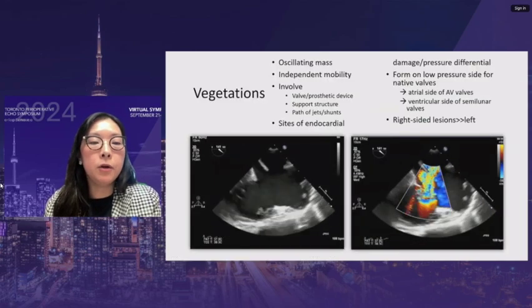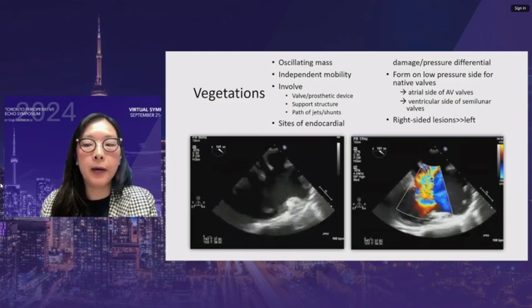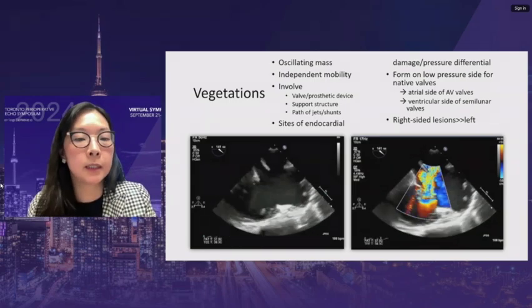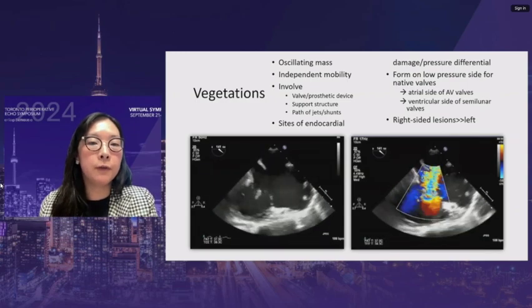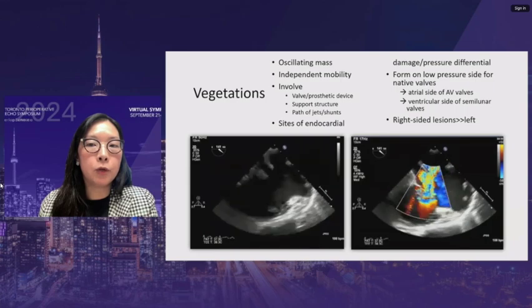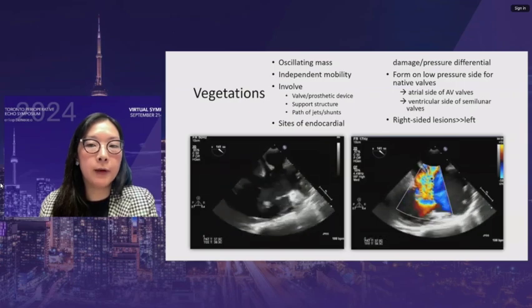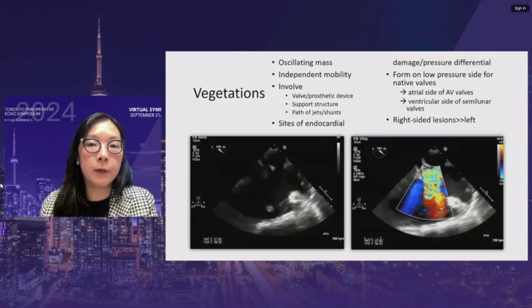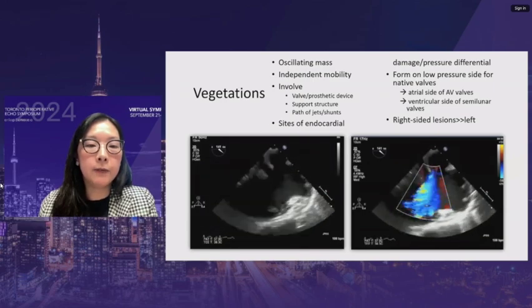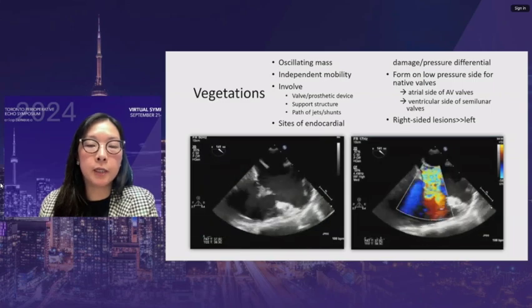Vegetations tend to be oscillating masses with independent mobility, without an alternative anatomic explanation. They usually involve the valve or prosthetic device, support structures, and are in the path of jets or shunts — typically at sites of endocardial damage or pressure differential. They form on the low-pressure side for native valves: atrial side for mitral and tricuspid, ventricular side for aortic and pulmonary. They can form at ASDs or VSDs. Right-sided vegetations tend to be larger than left-sided lesions, and yeast and fungal infections tend to be larger than bacterial lesions.